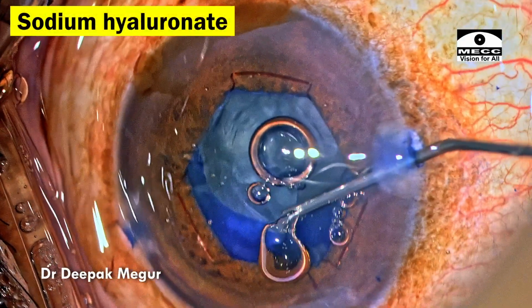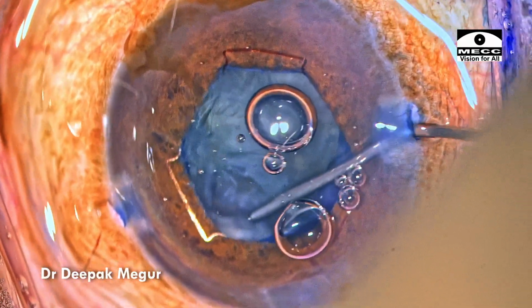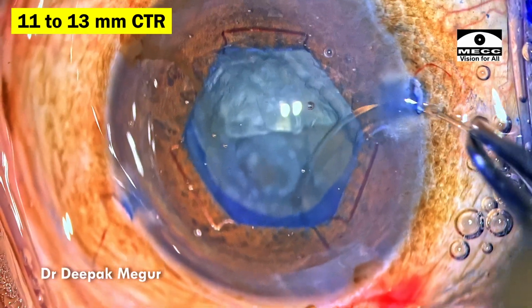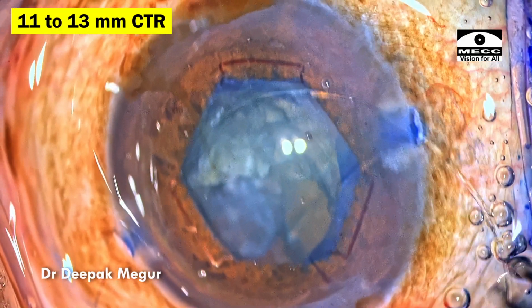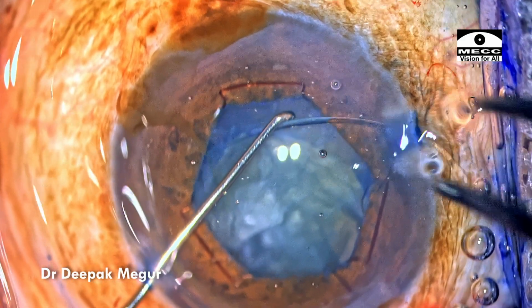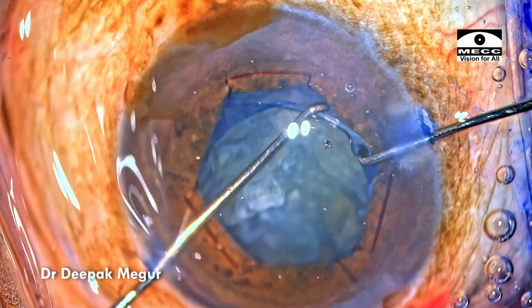Once a little bit of cortex is aspirated, I'm going to create some space under the rhexis margin by using sodium hyaluronate, and then the CTR, which is of the usual size, that is 11 to 13 millimeter, is being gently threaded into the capsular bag. I'm going to use the bimanual maneuver. So the second instrument is going to push the CTR to ensure that it doesn't stretch the rhexis margin.